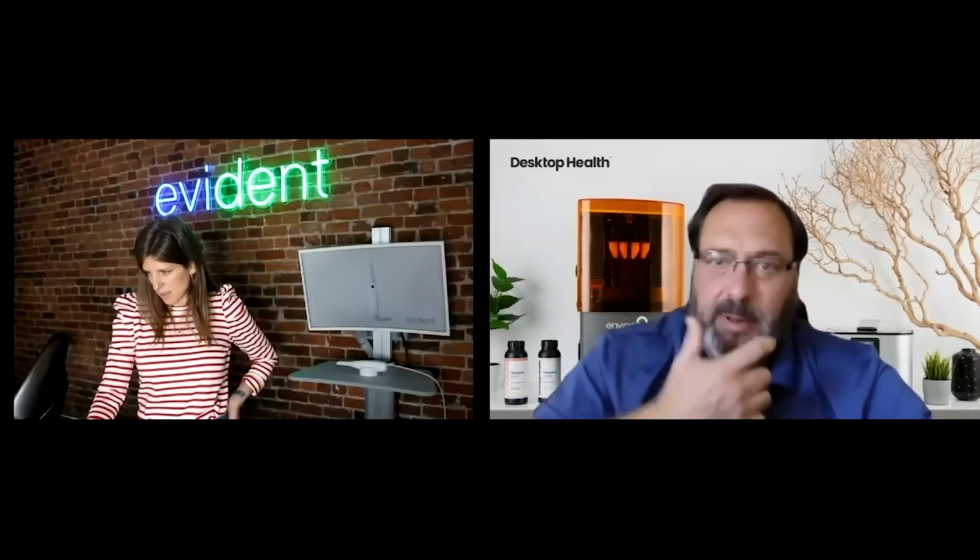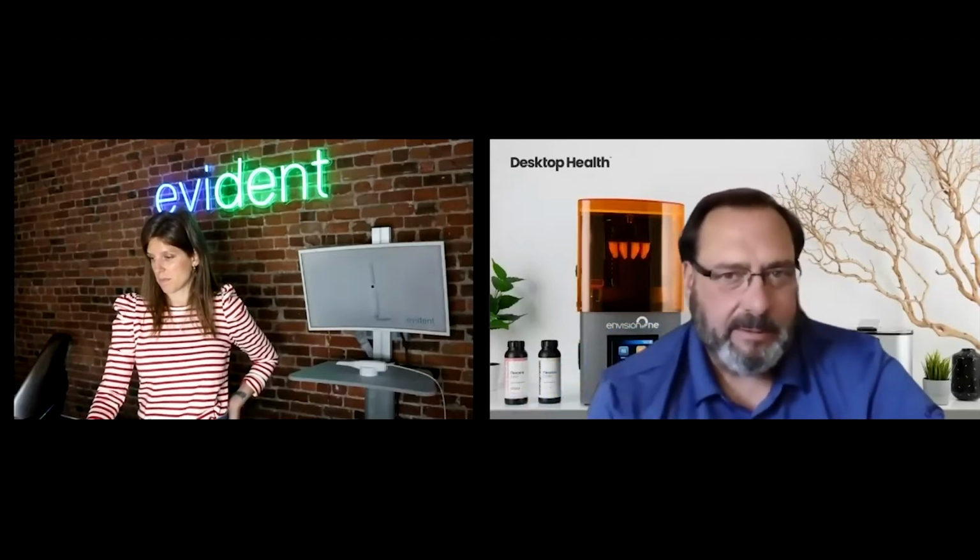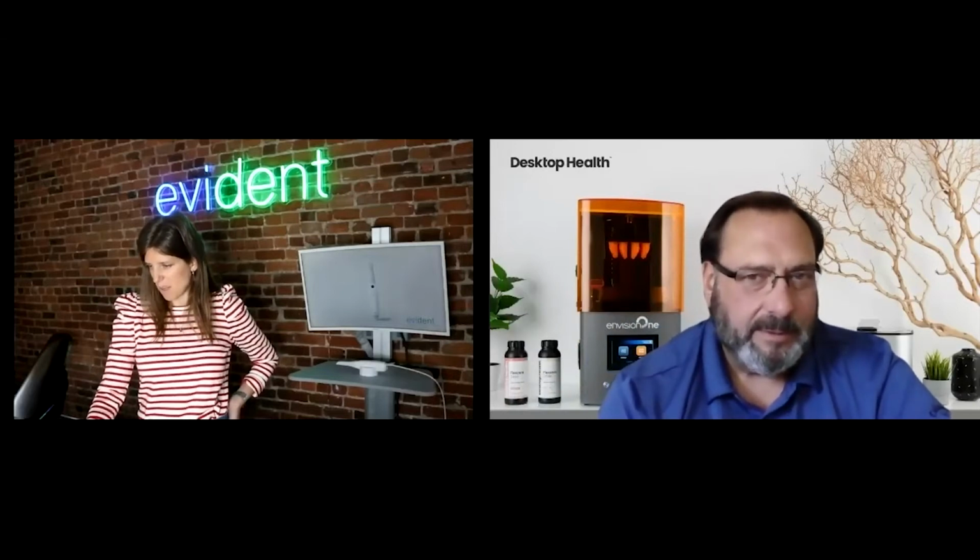Let's see, there's a lot of questions. This is awesome. Kevin, can you elaborate step by step on how you articulate the arches to get the relationship between how the patient bites so that the design service can know what the tooth setup should be? As far as getting the bite registration? You just take the bite registration as you normally do. And then you scan it in, and the bite block can be all scanned in. Perhaps you mean if you have an edentulous patient. Repeat the question again. If not, we can take it offline.